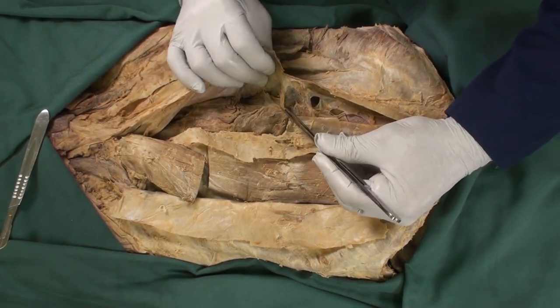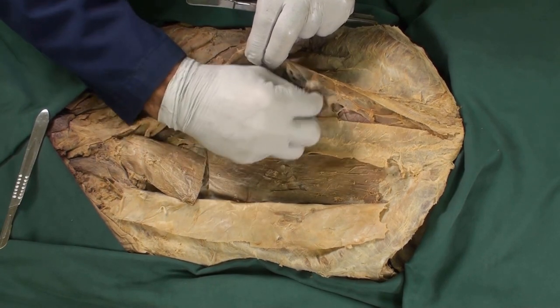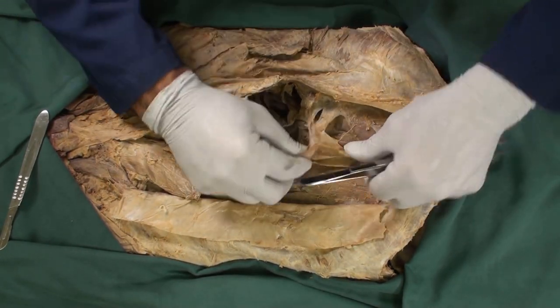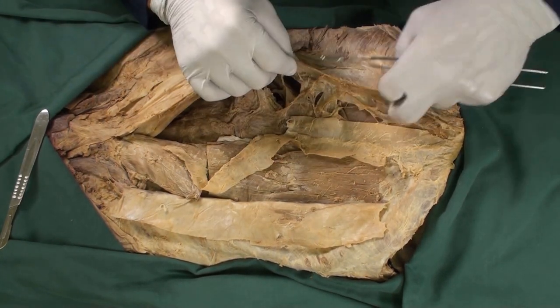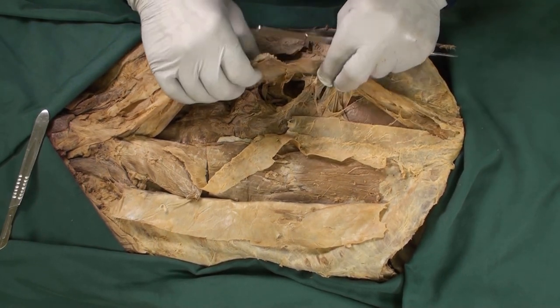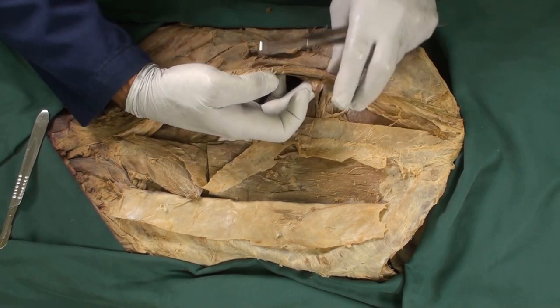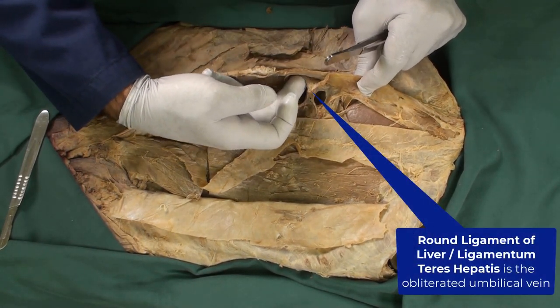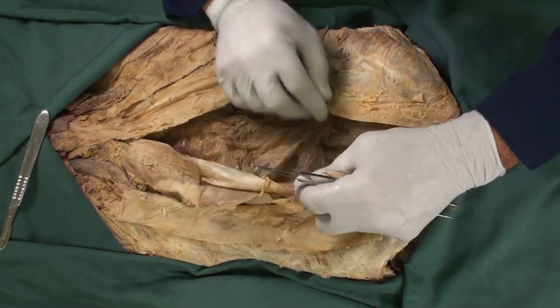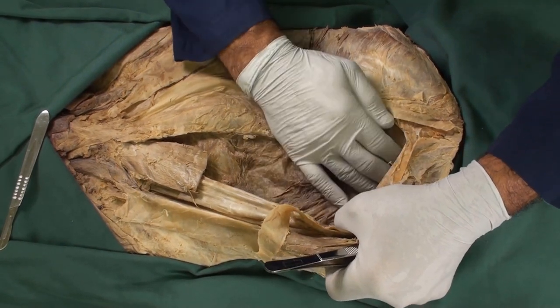Look at the attachment of the greater omentum, or the other parts of the abdominal contents, to the anterior abdominal wall. You can detach them with your finger. The attachment of the abdominal content to the anterior abdominal wall is not very much, which is good.